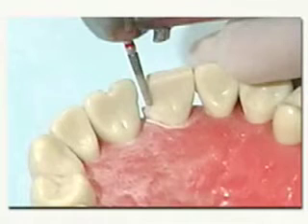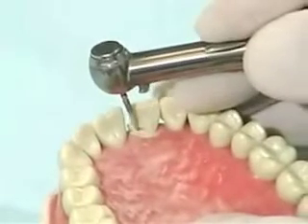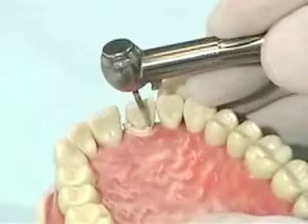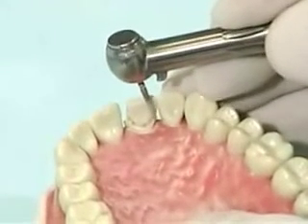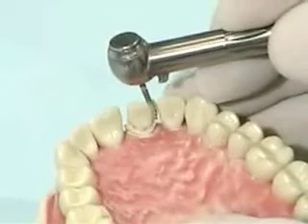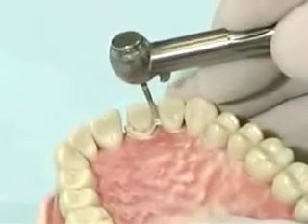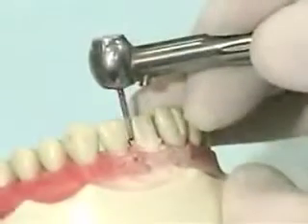The lingual surface is prepared in two planes. First, the cingulum area is prepared with a shoulder. From the mesial contact, follow around to the lingual surface, outlining the 1.5 millimeter shoulder around the gingival edge. Cut through the cingulum, continuing to keep the burr parallel to the long axis of the tooth so that you do not over-taper the tooth. Continue the shoulder preparation onto the distal surface, which should be about a 3 to 5 degree taper.